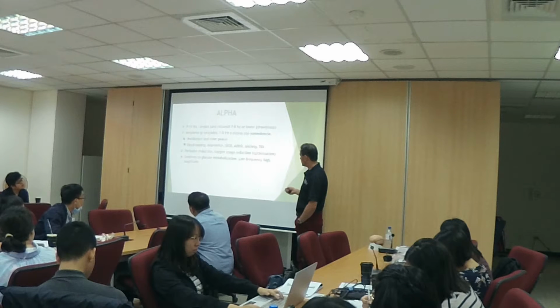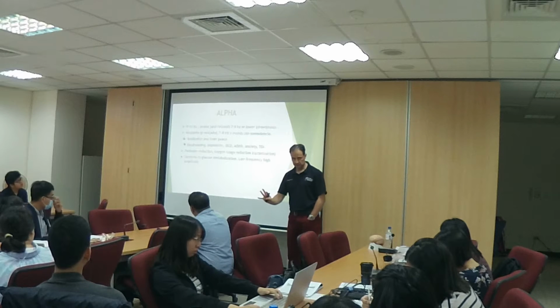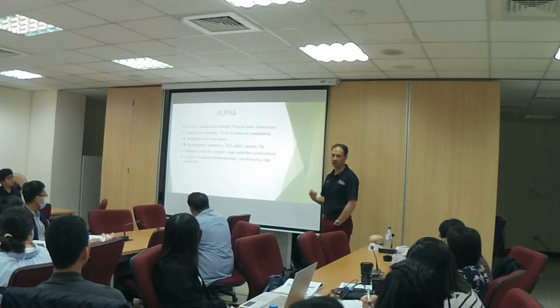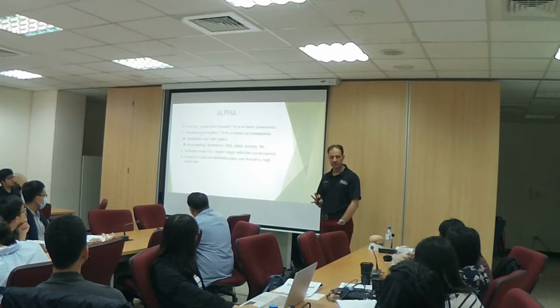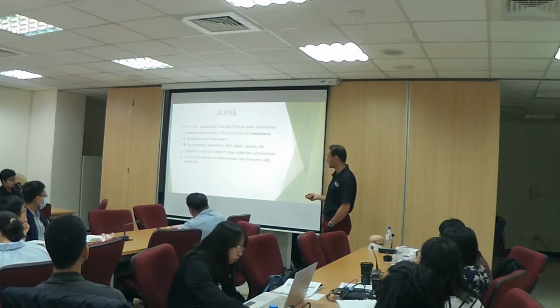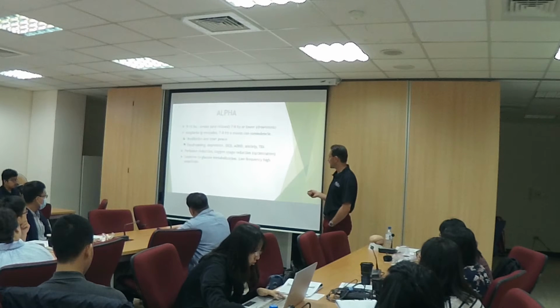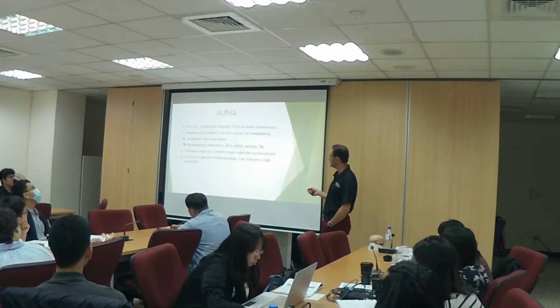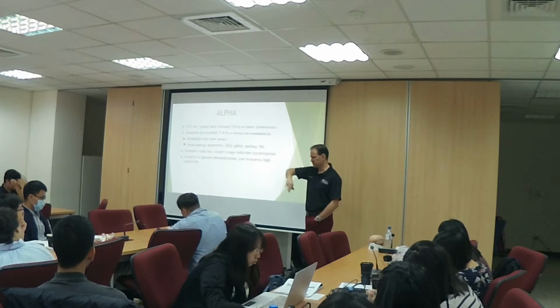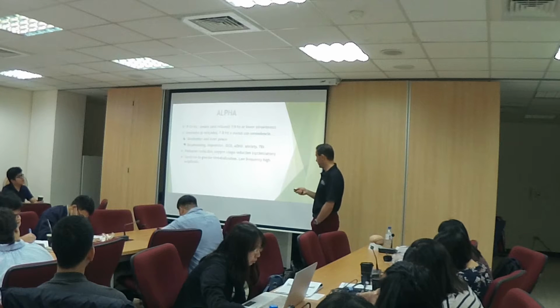And it's the optimization, again. So the brain is in an idle state, it's resting. Okay, so it's good for the brain. We need alpha for the brain because we need it to rest. We cannot go on and on and on all the time. At some point we need to be rested and ready to respond. Again, sensitive to glucose metabolization, so sugar diets will help it. Especially if it is low frequency, high amplitude. So low frequency, high amplitude means it's low alpha, 8 to 10, 8 to 9 hertz. You will see in the EEG it is really high and synchronous. So it will really, really ruin your day.